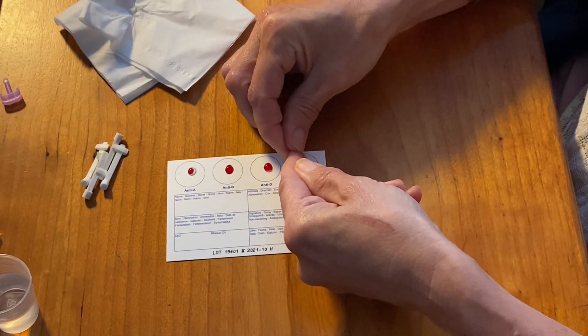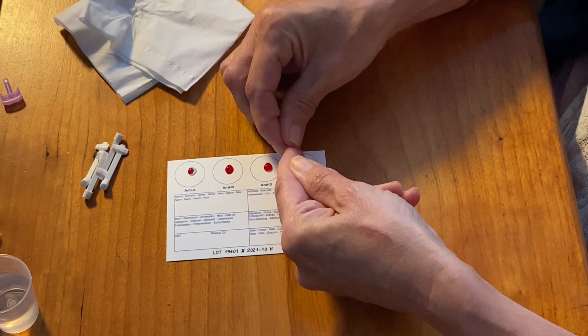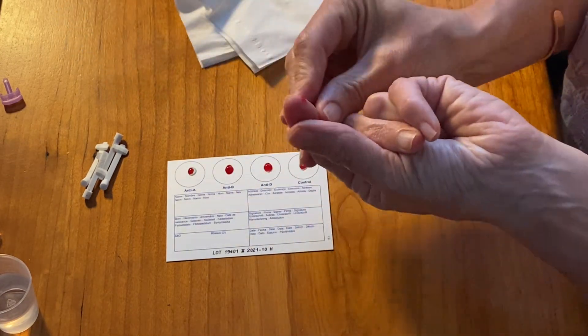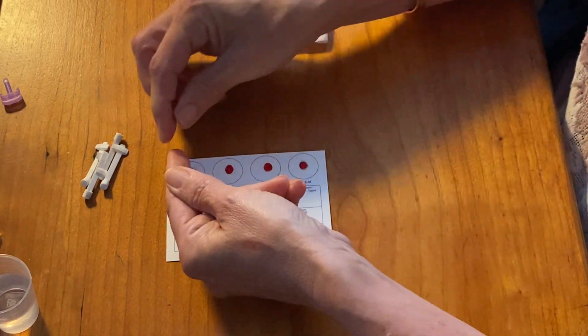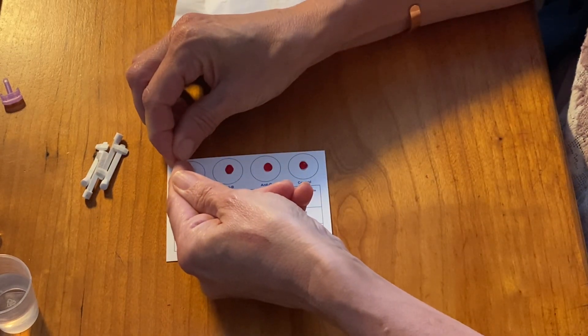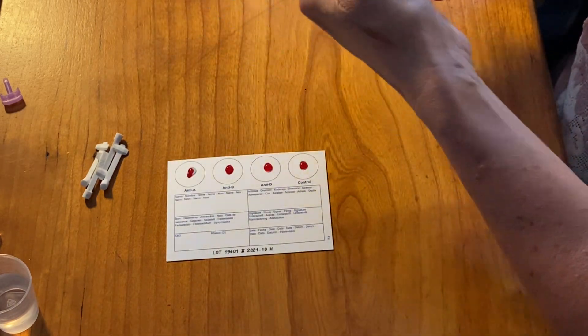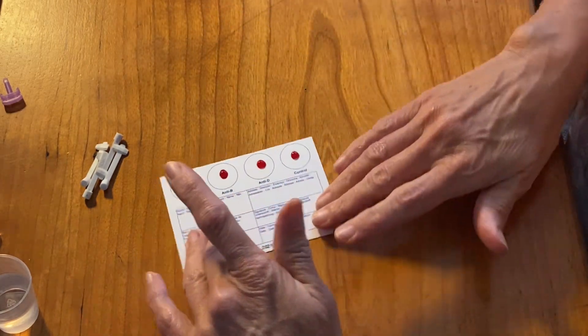And this is the controlled one. Lovely. I'm just going to put another little bead of water onto this one to make sure there's enough. Okay, so that's your finger. That's the blood part done.